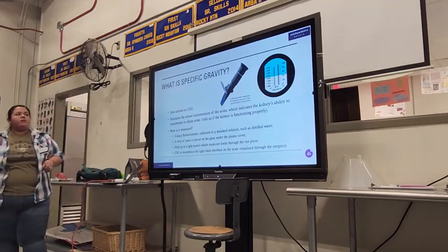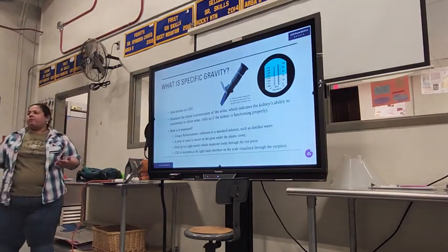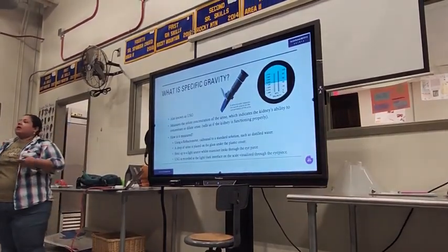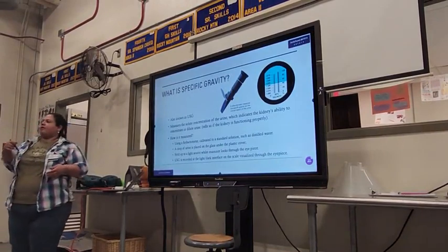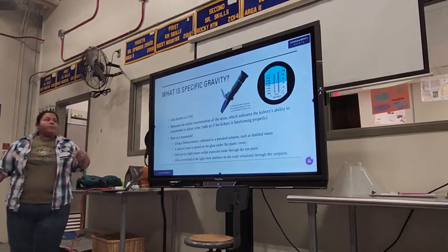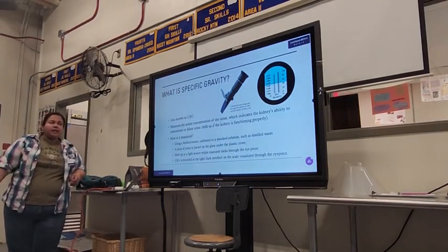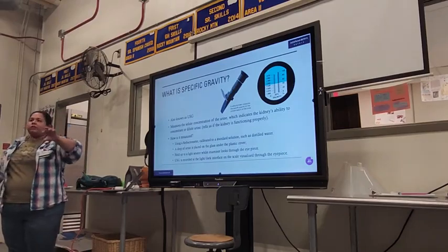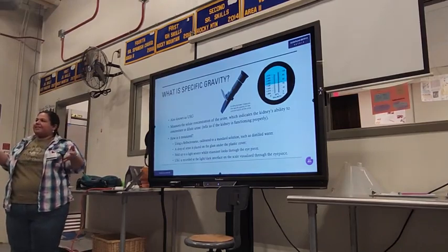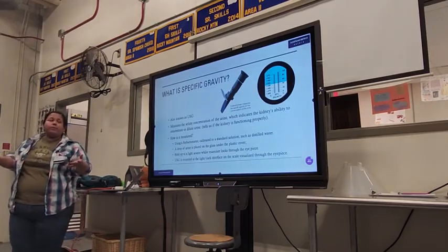All right. So let's talk about specific gravity. Well, what is it? How many of you have ever heard of specific gravity before? Okay. Well, specific gravity can also be called urine specific gravity, which leads me to its acronym, USG. It measures the solute concentration of the urine, which indicates the kidney's ability to concentrate or dilute the urine. So it tells us how much sediment is in the urine. This obviously tells us if the kidney is working properly.